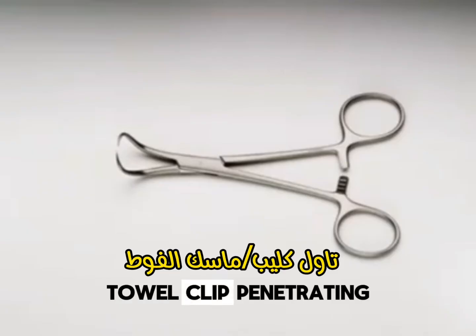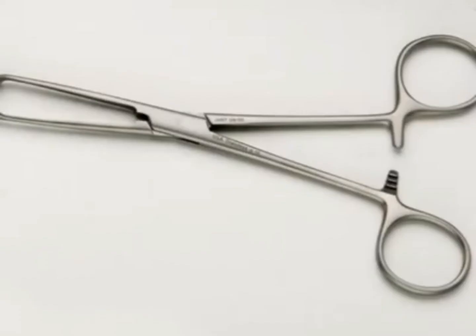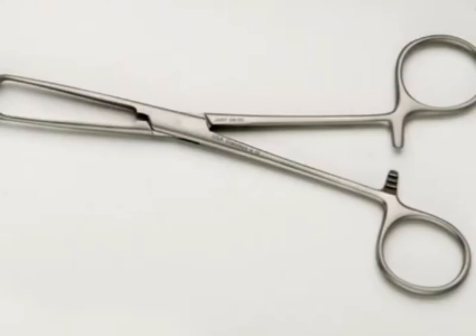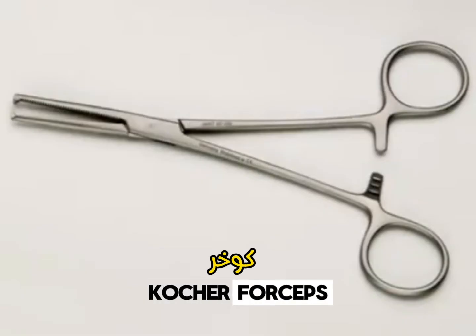Towel Clip Penetrating. Forrester Sponge Forcep. Allis Forceps. Babcock Forceps. Babcock Forceps. Kocher Forceps.